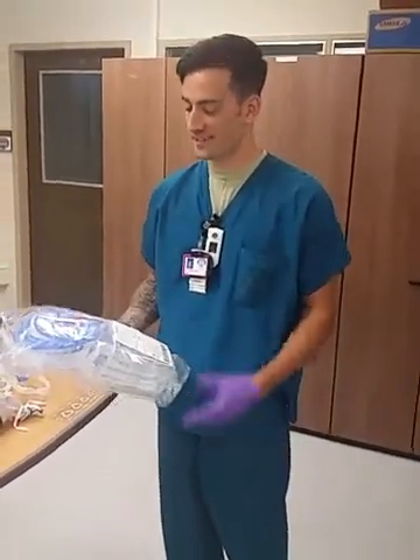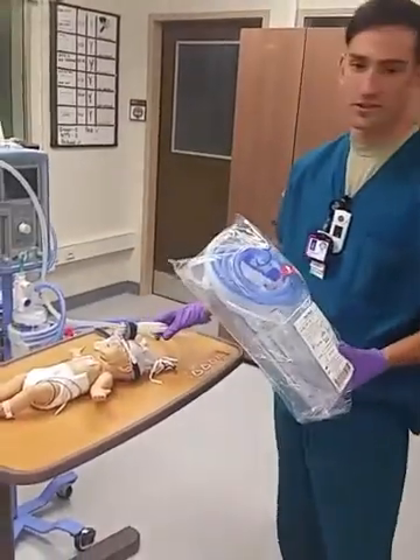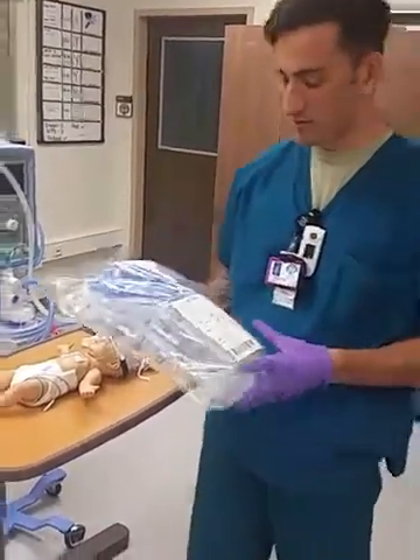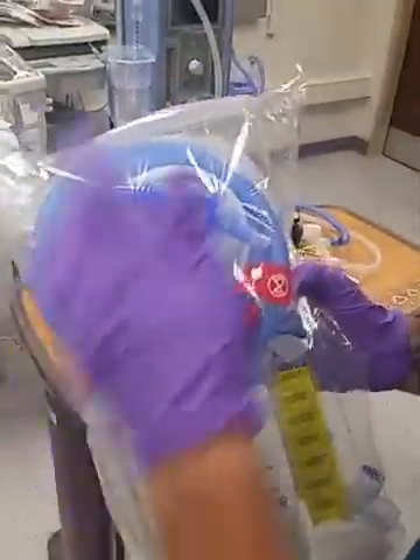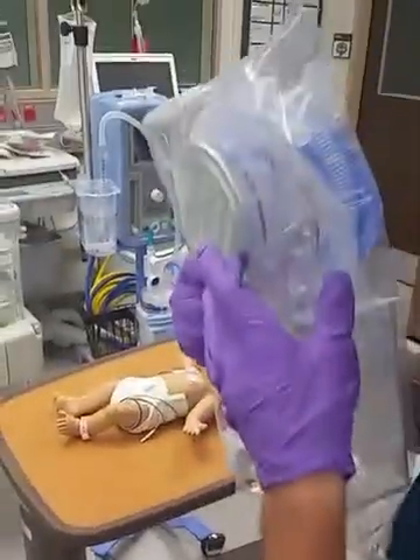Hey guys, I'm Sergeant Huey going over the bubble CPAP system and the new flexi trunk system that we just got. So first things first, here's the circuit system — it's gonna have an inspiratory limb, expiratory limb, comes with your bubble CPAP container and a heater circuit.